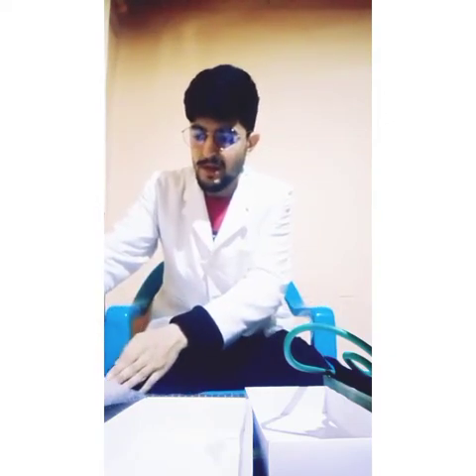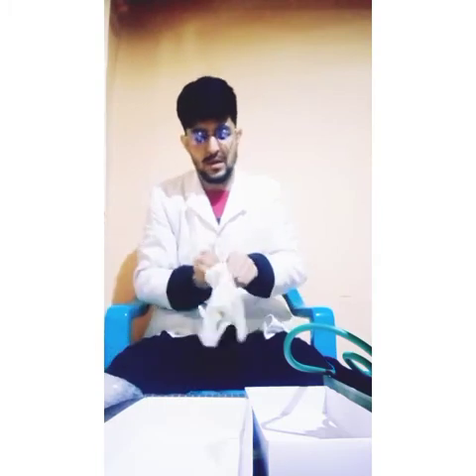Then with the alcohol we use the same 5 methods, and thumbs. After cleaning our hands, we wear our gloves by the 3 finger technique.